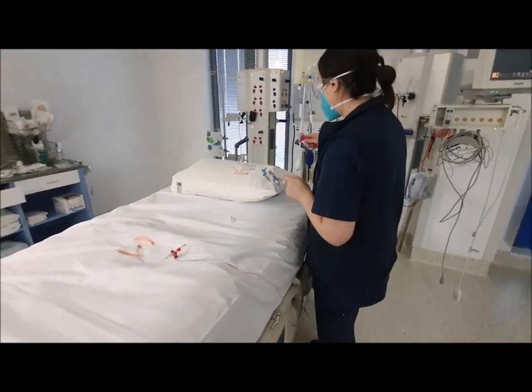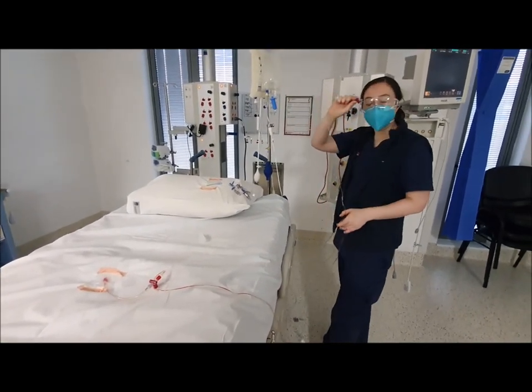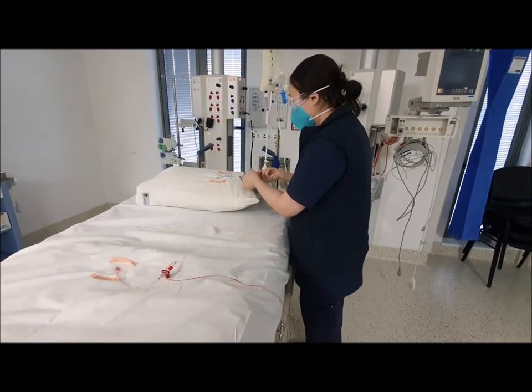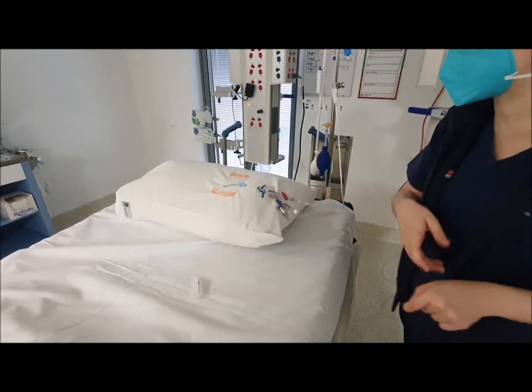CVP monitoring is needed in order to do your cardiac output studies, which is what you're aiming for with Pico. I've already got one pressure bag primed and a monitoring line primed already, and I'm going to attach it to one of the lumens on the central venous catheter.